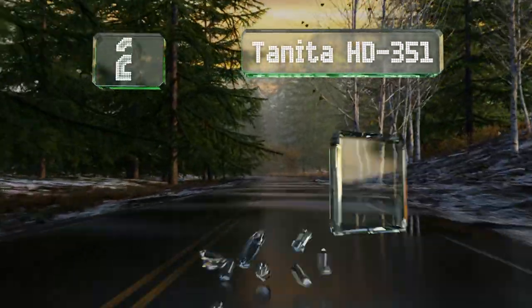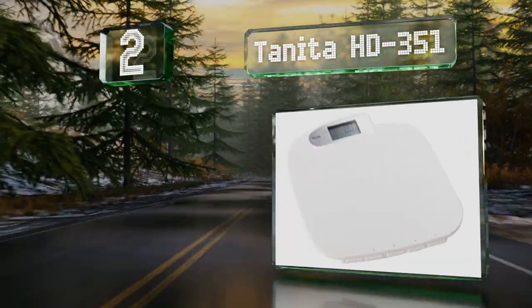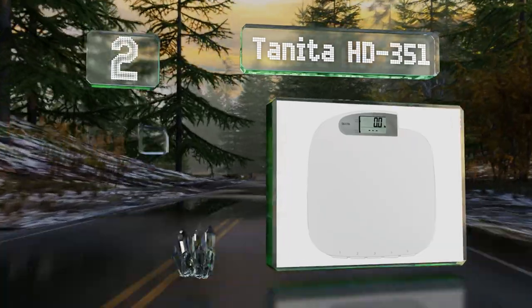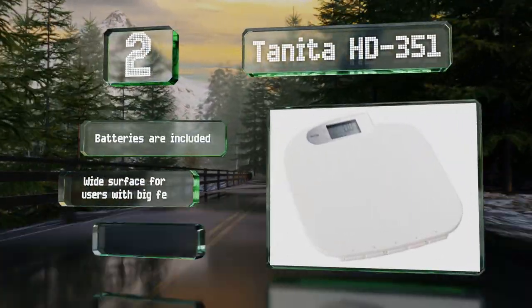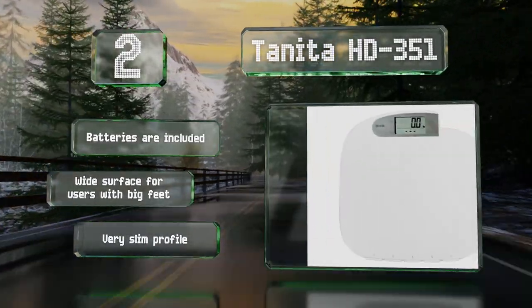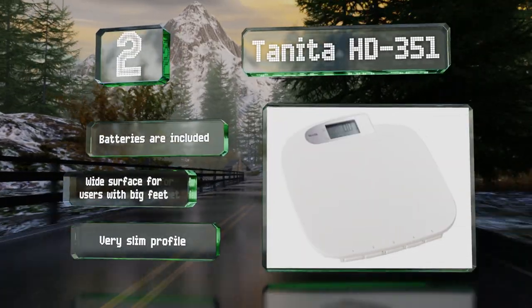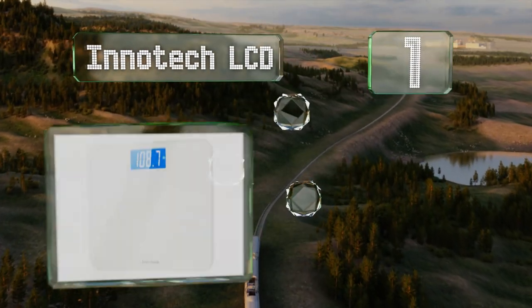At number two, if you feel like you're never getting anywhere with your weight loss efforts, the Tanita HD 351 has a memory function that will track and store your information over time. It's good for motivating yourself and seeing the results of all your hard work. It comes with the required batteries and a wide surface for users with big feet, and it's got a very slim profile too.